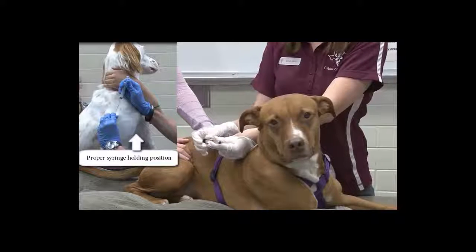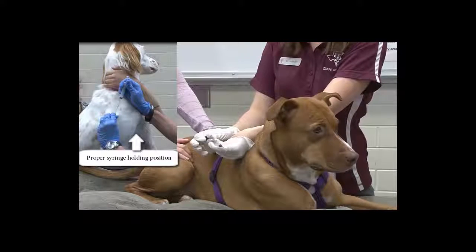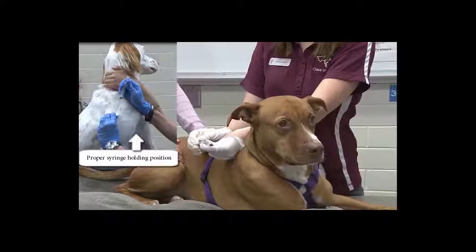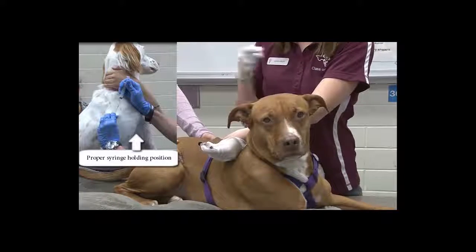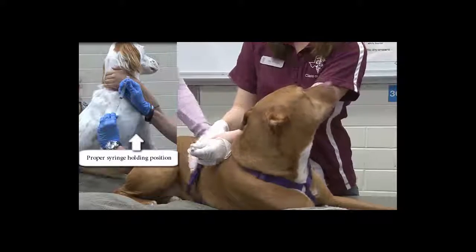Once you have it injected under the skin, you want to pull back. It should be a little bit hard to pull back. You shouldn't get any blood in there, but if it pulls back really easy, you've just gone through the skin, and you're going to give the injection on the other side of the skin.